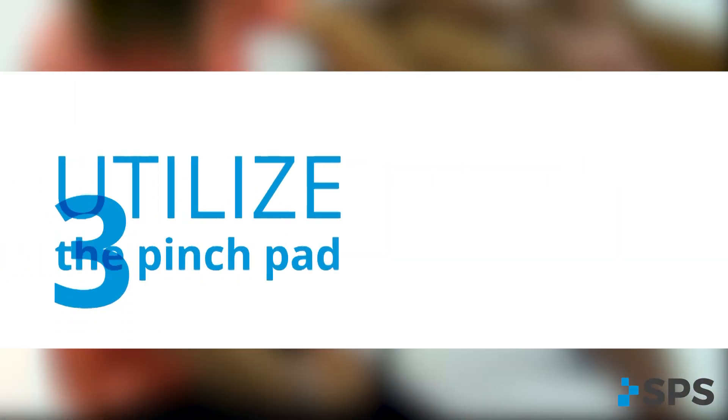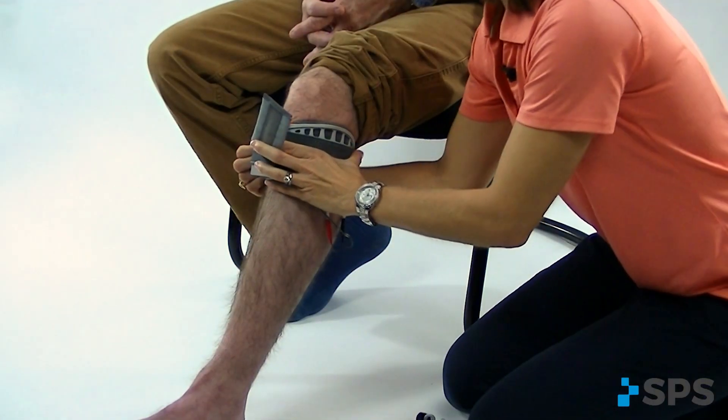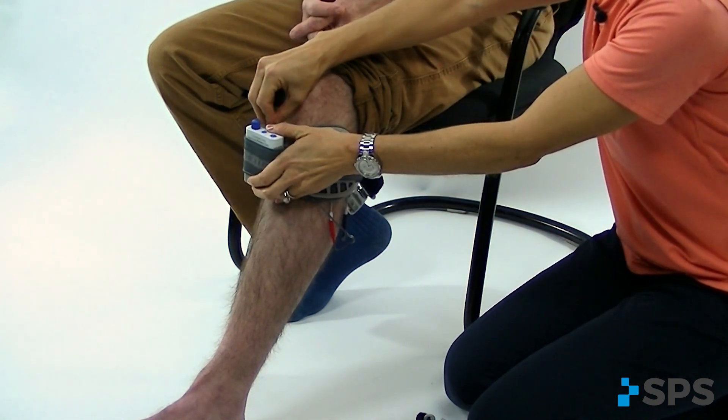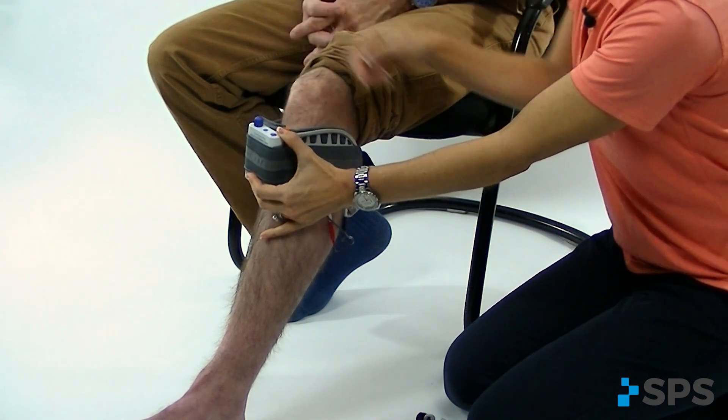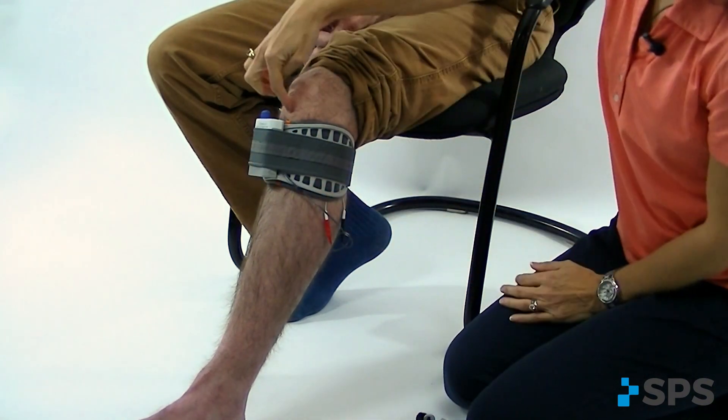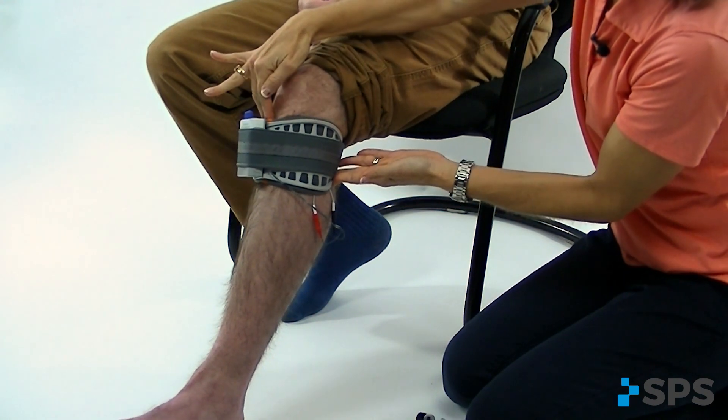Another option is to take a pinch pad and stick it inside the anterior medial aspect of the cuff. What that does is it takes up the slack and pulls the entire cuff from behind the fibular head towards the front of the leg, and that will give you the contact you need to get reproducible dorsiflexion.